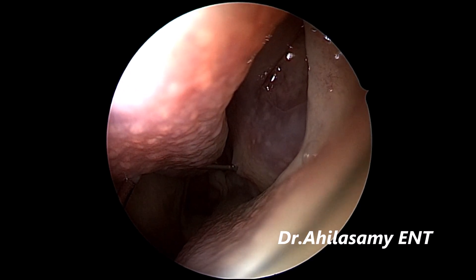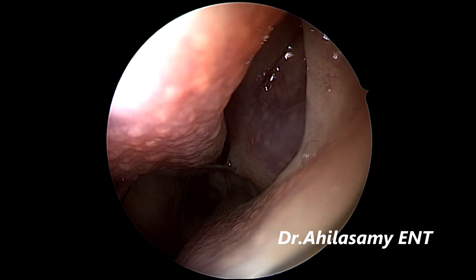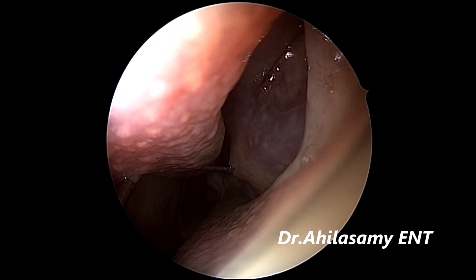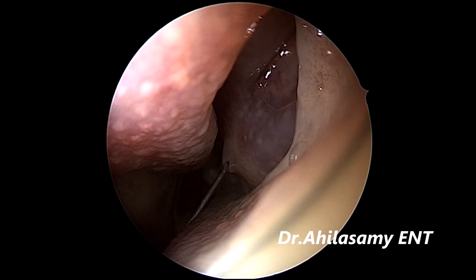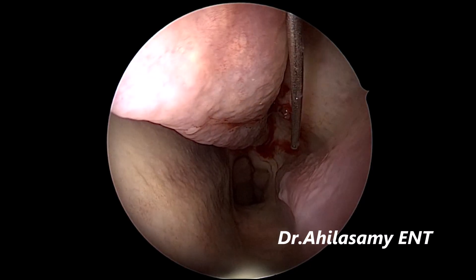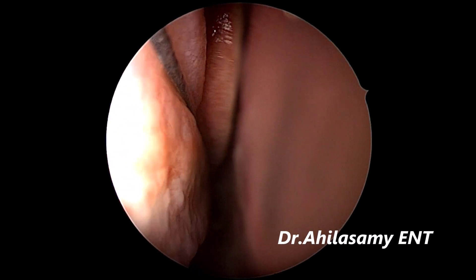It is at the posterior end of the middle turbinate joining the lateral wall. With a 23-gauge spinal needle with the tip bent for around 1 cm, always aspirate and give.